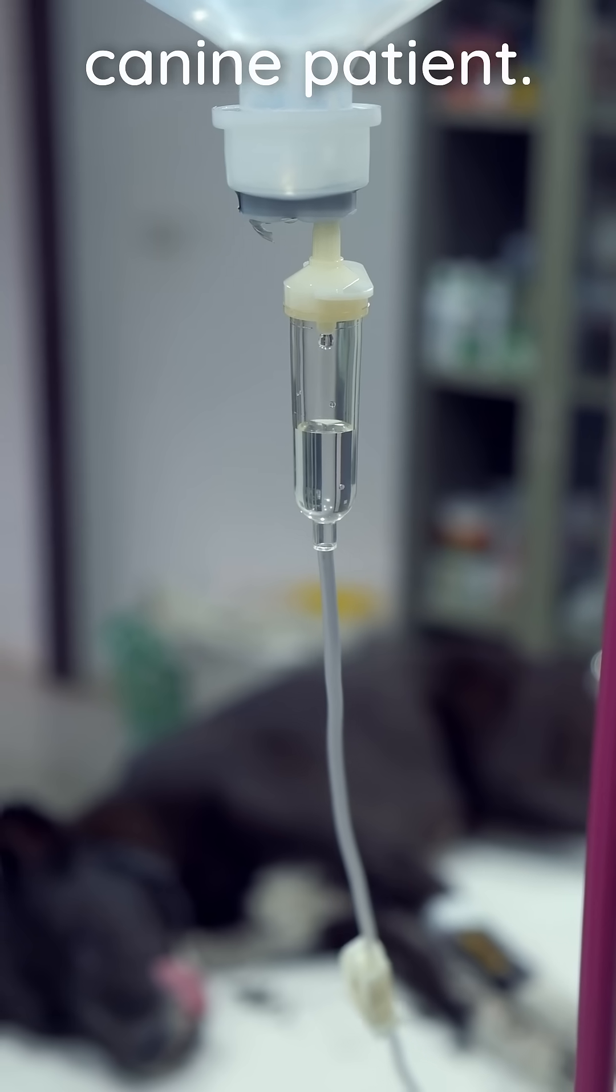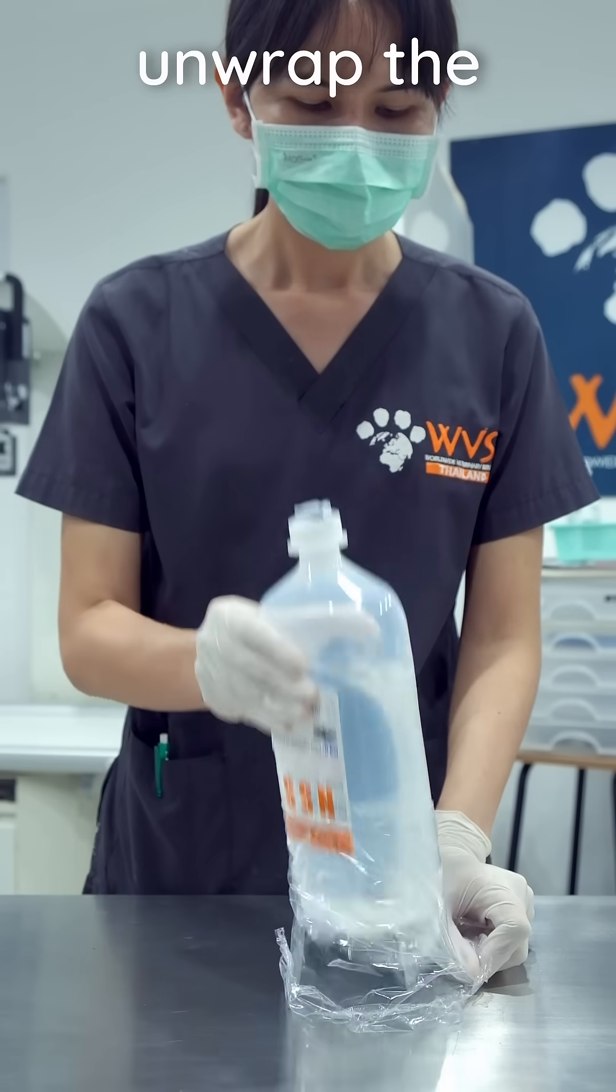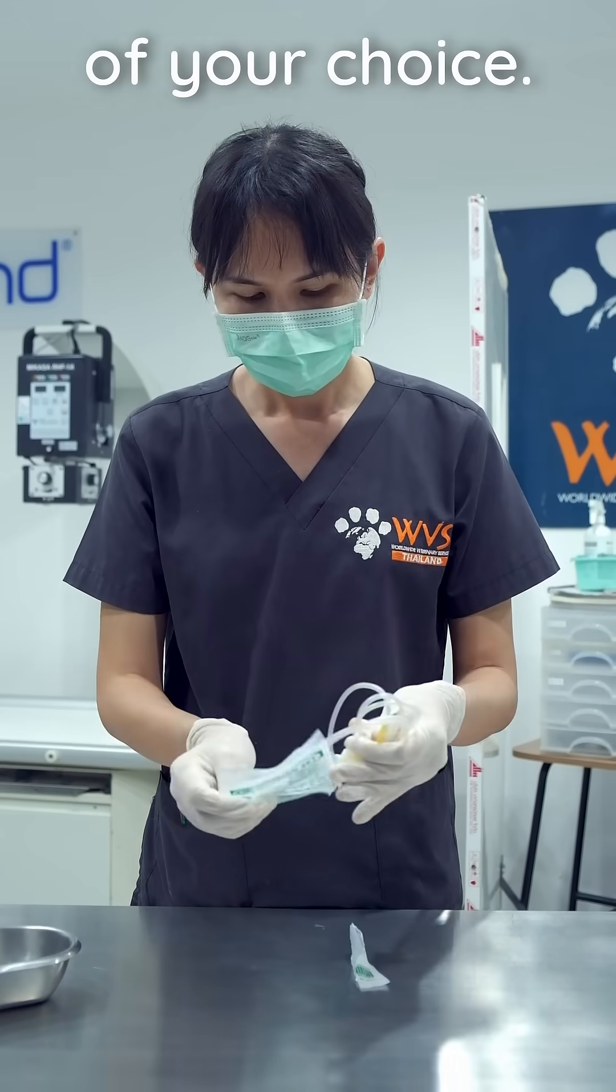How to set up an IV fluid line for a canine patient. With clean hands, unwrap the giving set and fluid bag of your choice.